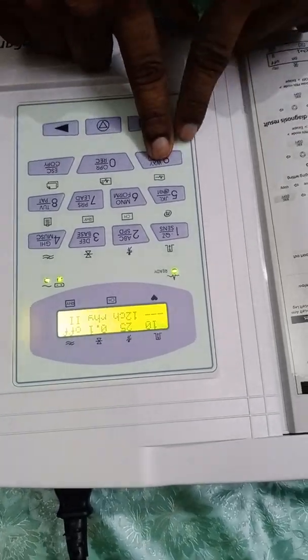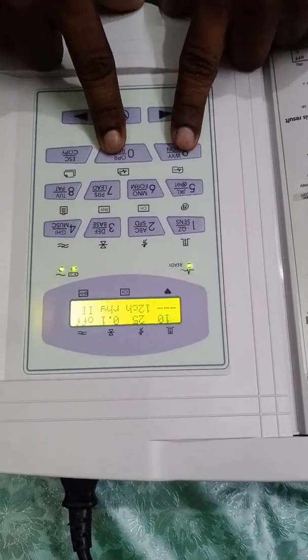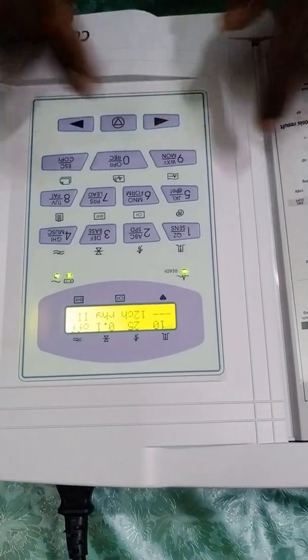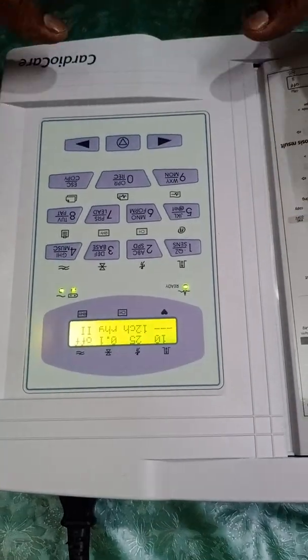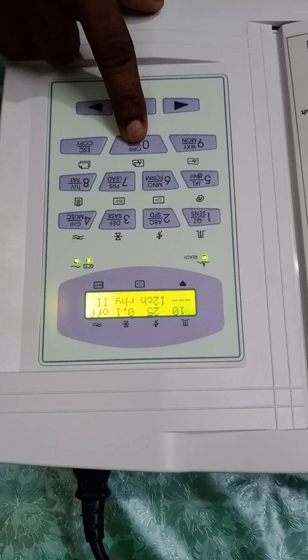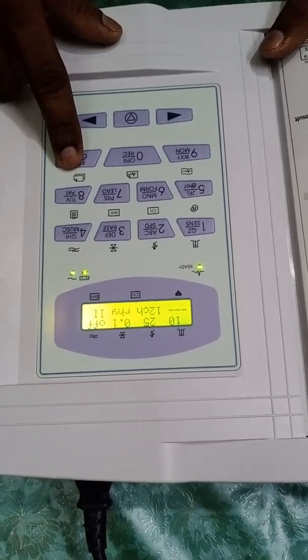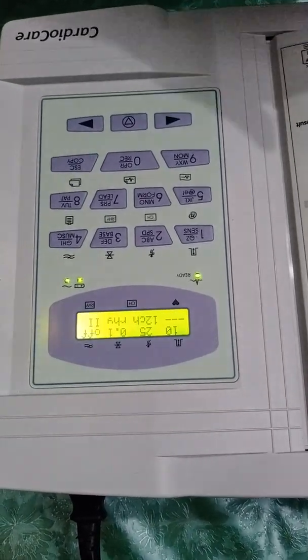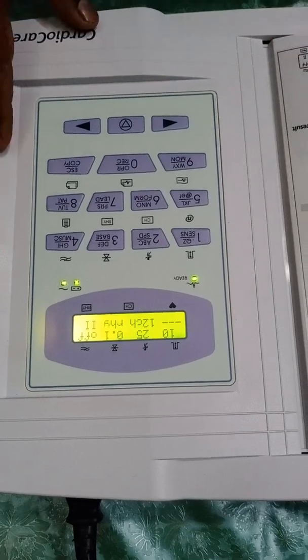These are the three recording options. The first is the rhythm-wise recording option. The second is the standard recorded printing option — this is the main important recording button we use. The third is the copy recording option. When a doctor requests a particular rhythm for clarification you can use the first button, but for a simple primary ECG diagnosis you use the standard record button. Once an ECG is already recorded, the copy button lets you print another copy without re-recording the patient.